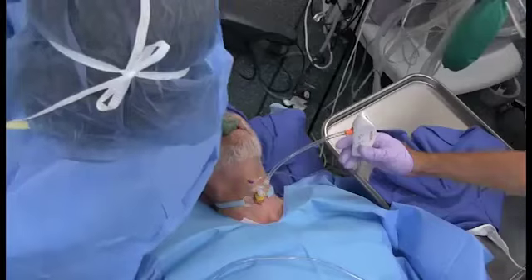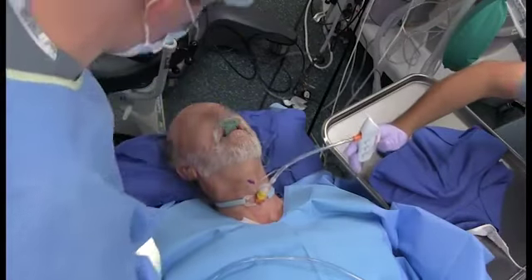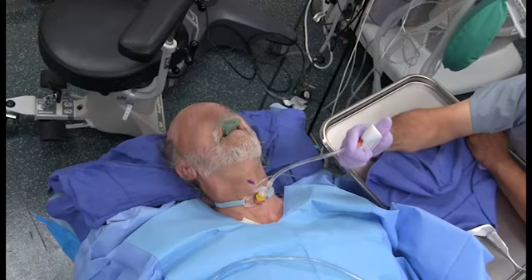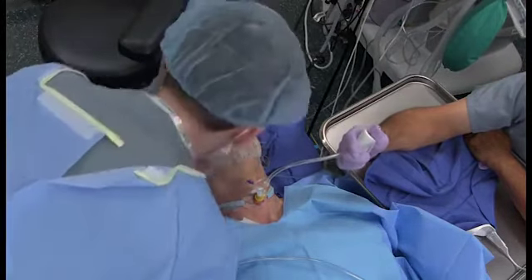When the stenosis has been adequately resected, the suspension laryngoscope is removed. Total intravenous anesthesia is now stopped. Transcricothyroid membrane oxygenation and ventilation will be continued until the patient begins to breathe spontaneously.